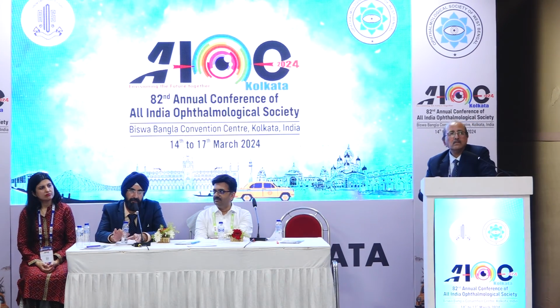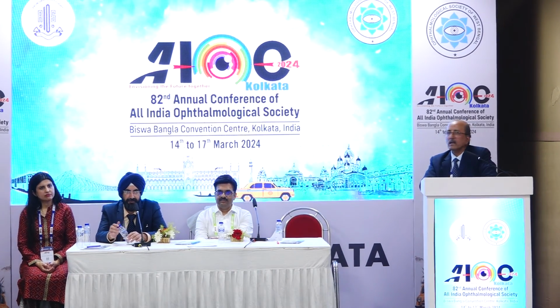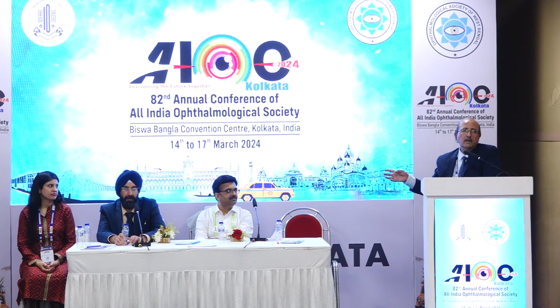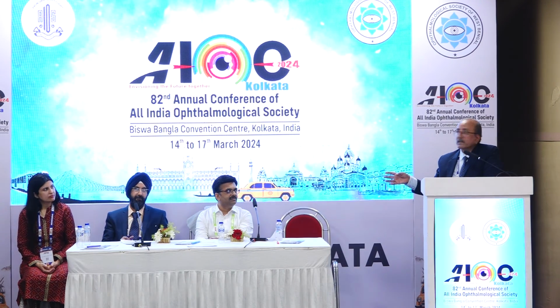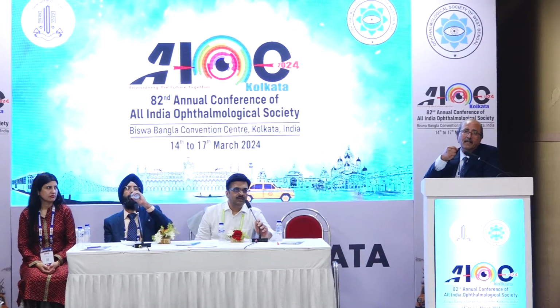I think in young children who do not cooperate for optical biometry, this is all a rough estimate of the IOL because they are not fixating. So you have an A scan with which you are doing the axial length, and you are bound to get errors. Dr. Love very nicely showed intraoperatively how we do the keratometry.